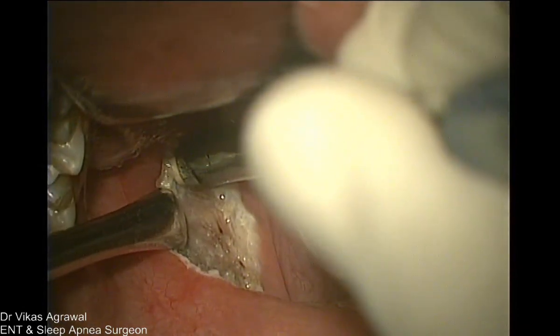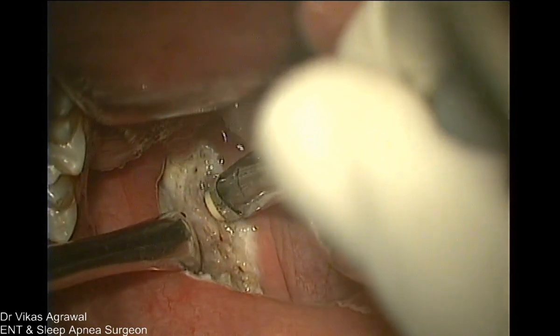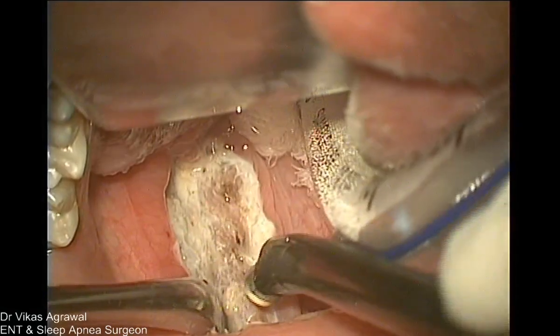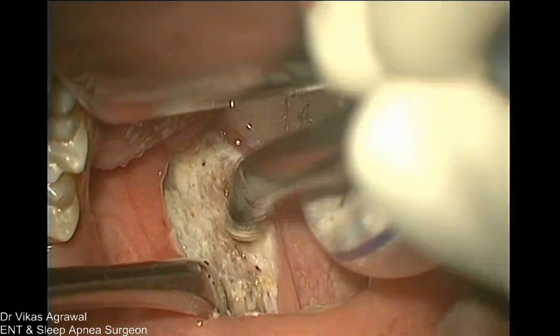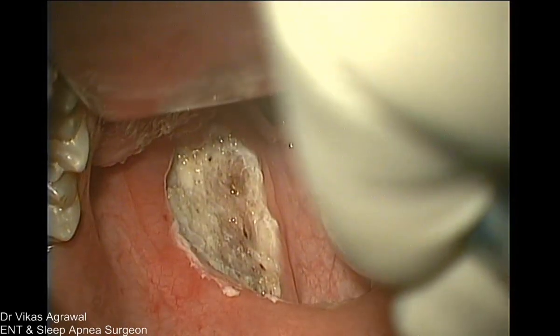Okay, so this is the lower pole of the tonsil which we have not completely removed. This is the coagulation of the vertical fiber of the palatopharyngeus, so that this will become fibrosed. When it becomes fibrosed, it cannot fibrose in this direction. The fibrosis will always be in this direction, which is good.